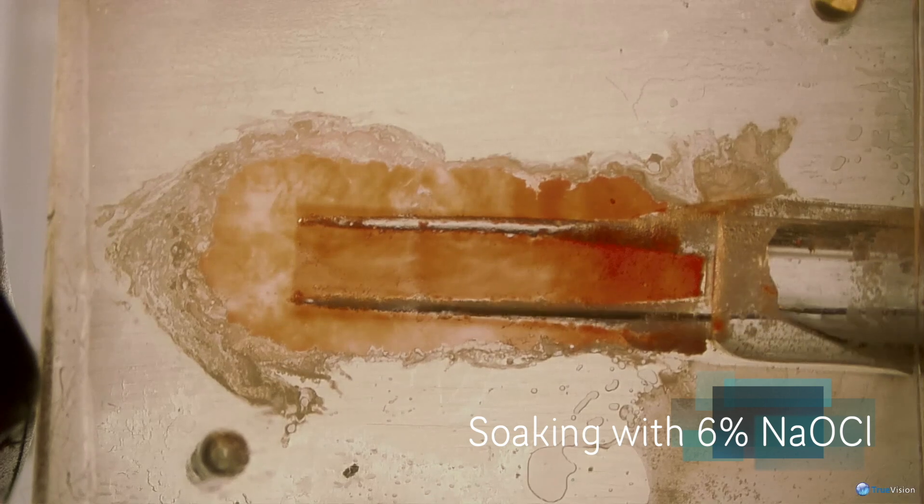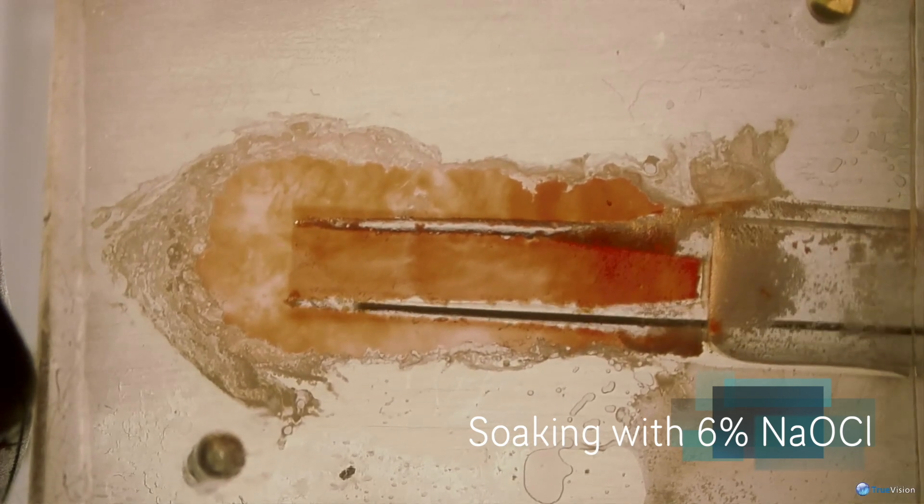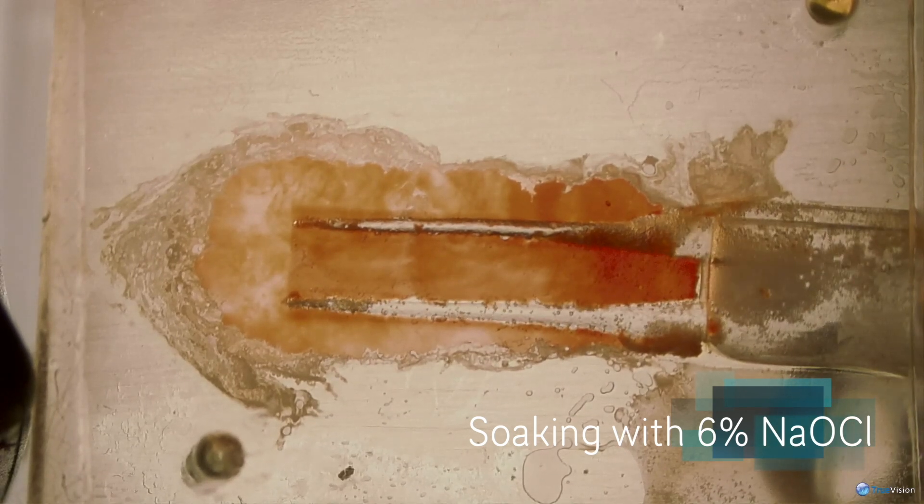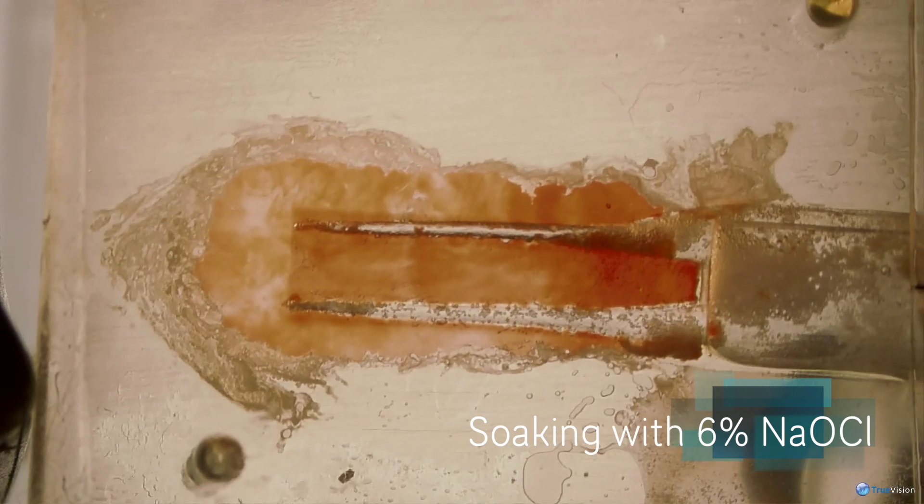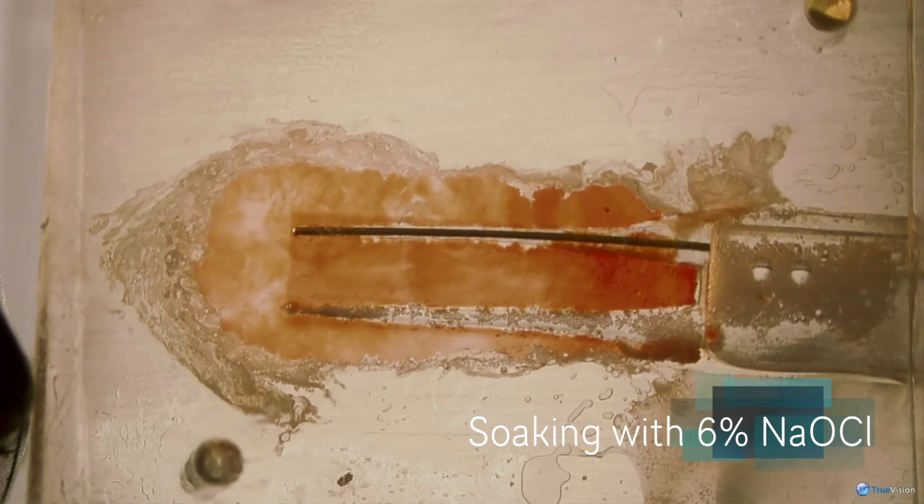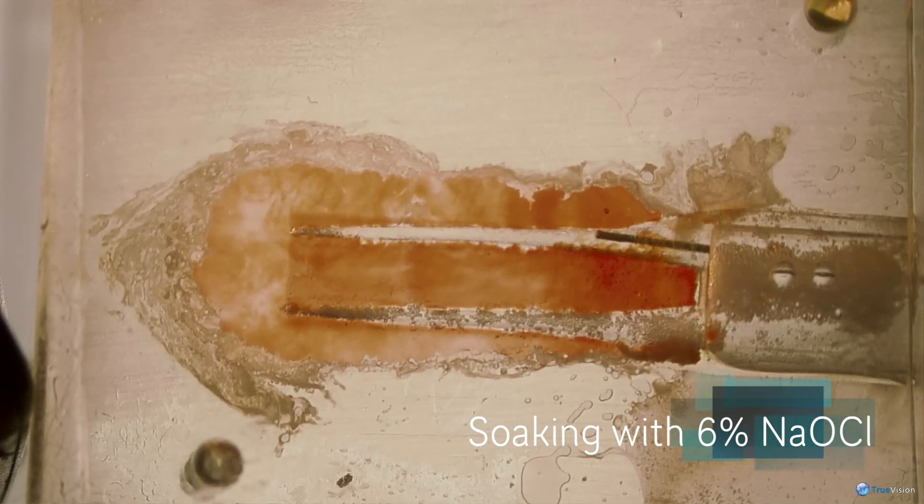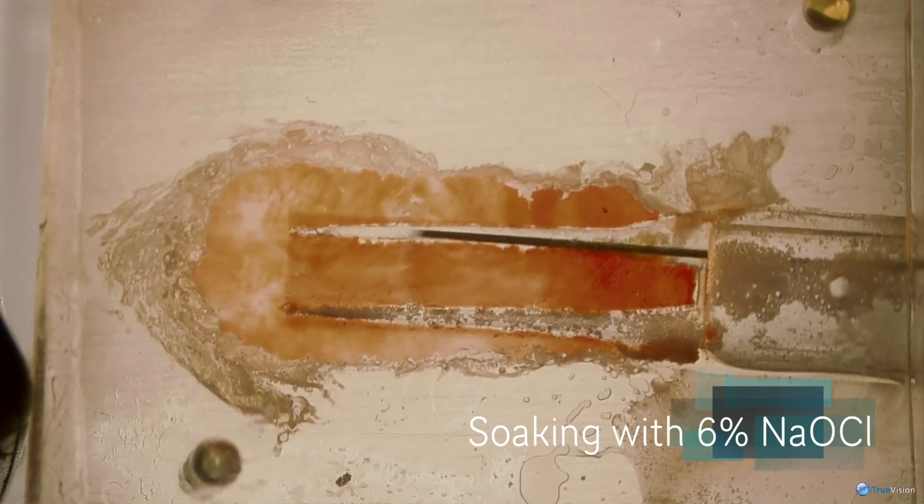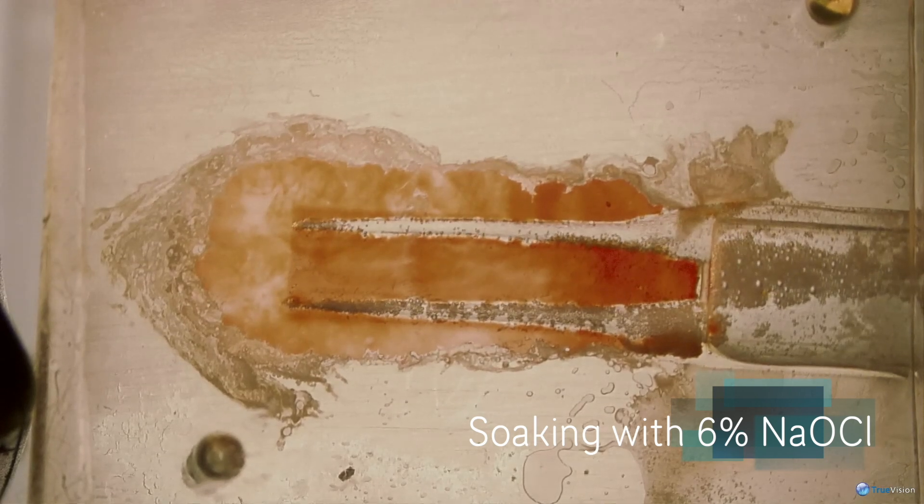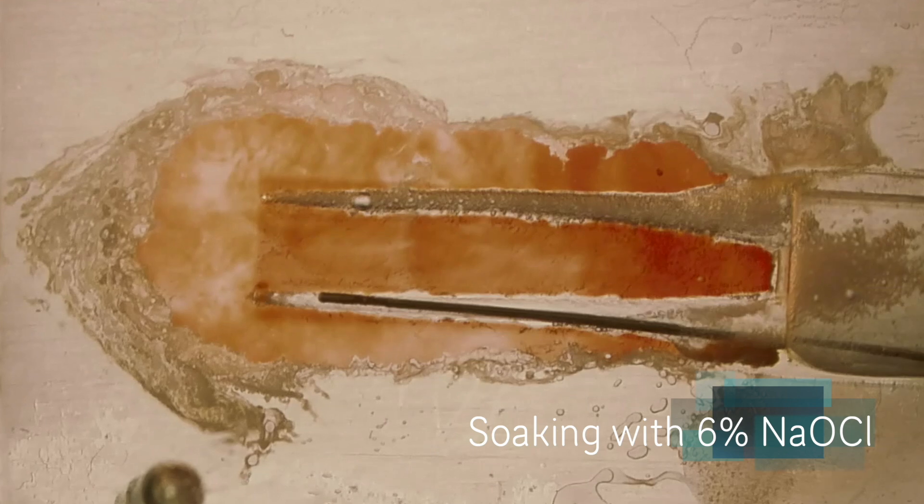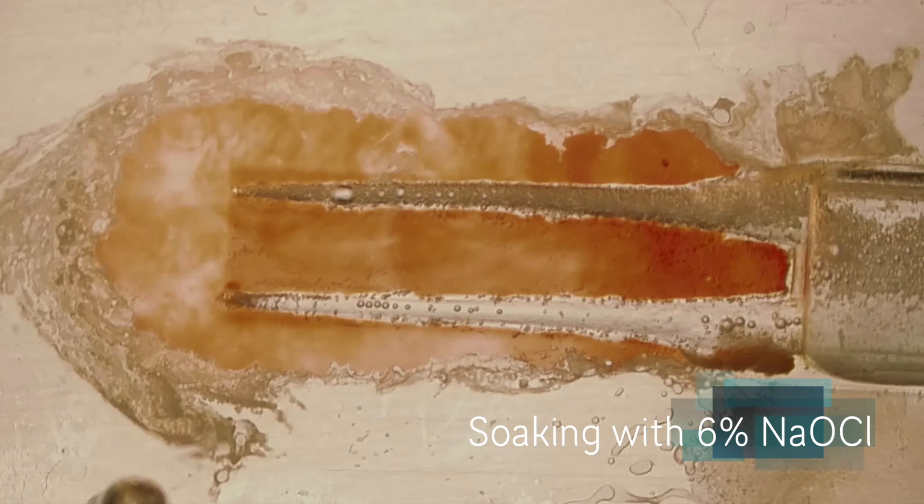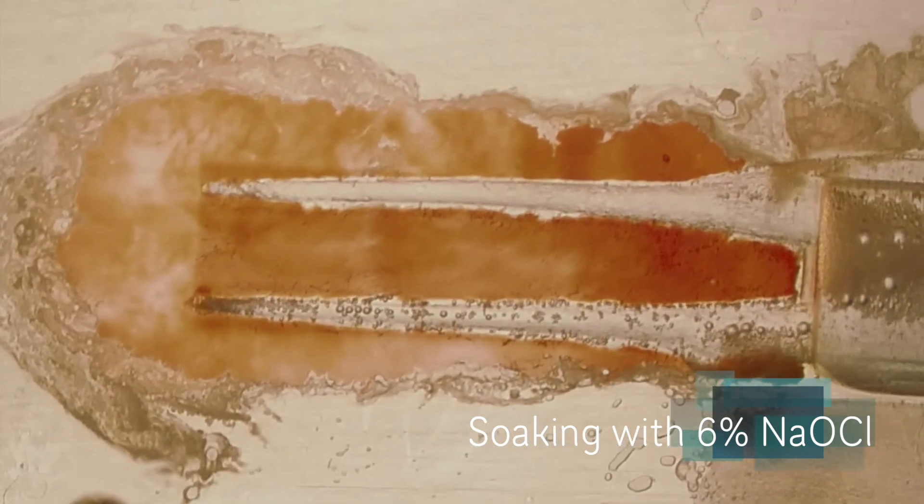Let's take a look at what happens during soaking with hypochlorite in another model, the replica. Positive pressure irrigation. It's a little tough to find that canal orifice. It wasn't that smooth. This is what we all do at the start of the irrigation procedure, often activated as well. Once we get the particulate matter out of the primary canal, then the hypochlorite has a better chance of doing its job.